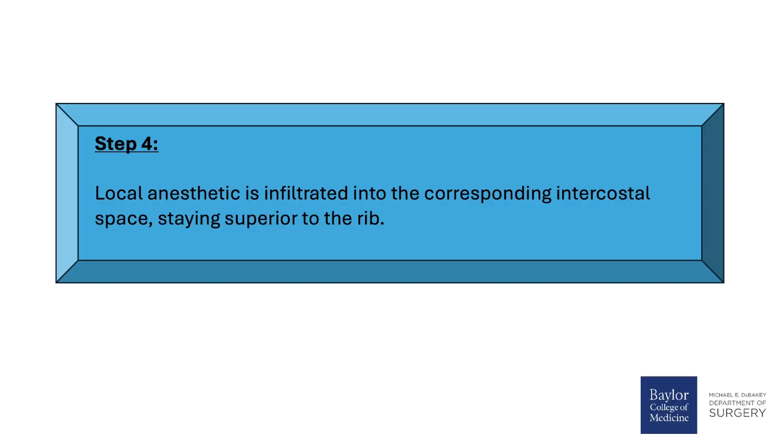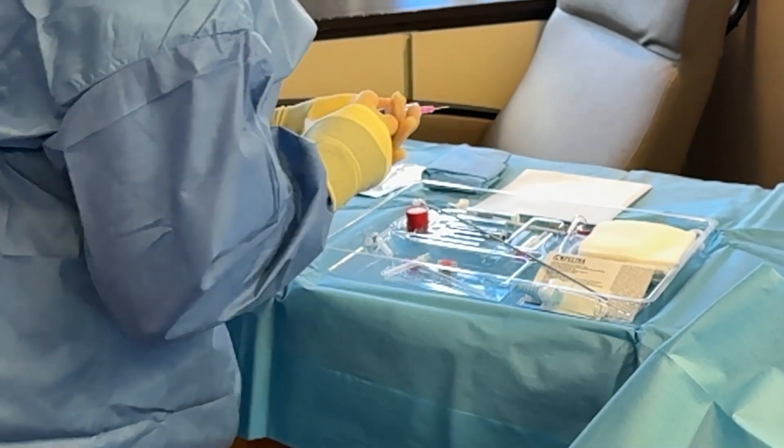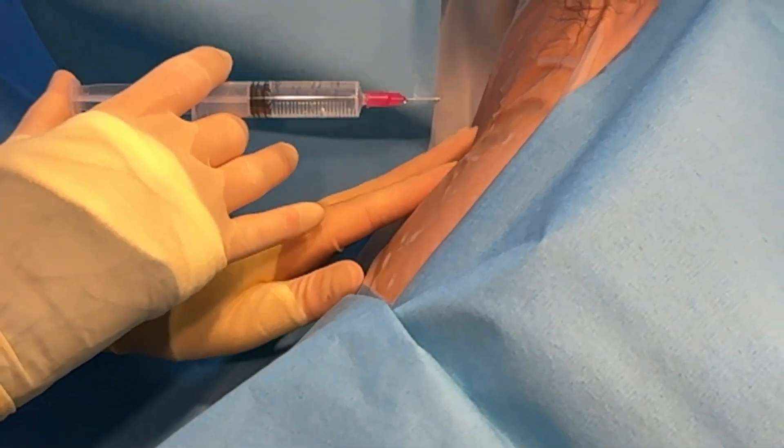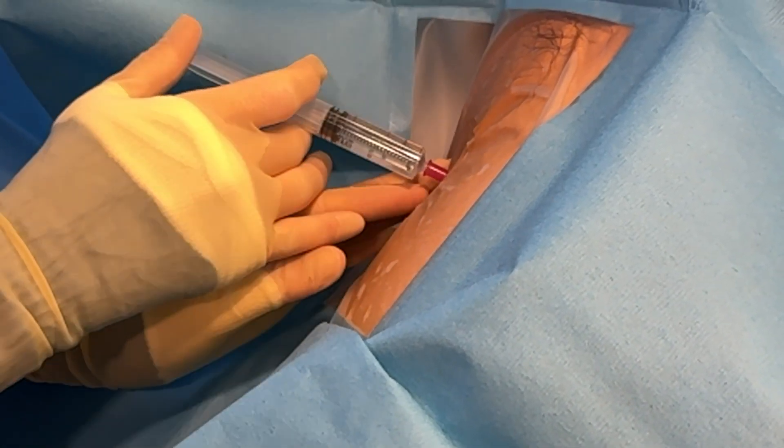Step 4: Local anesthetic is infiltrated into the corresponding intercostal space, staying superior to the rib. The provider communicates with the patient: 'I'm just feeling right where your ribs are — this will be the pinch and the burn.'